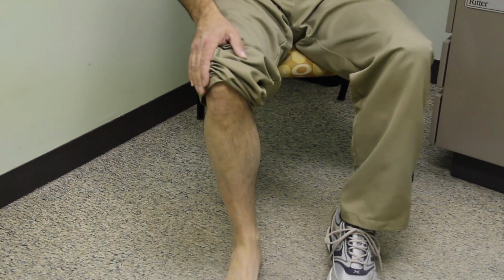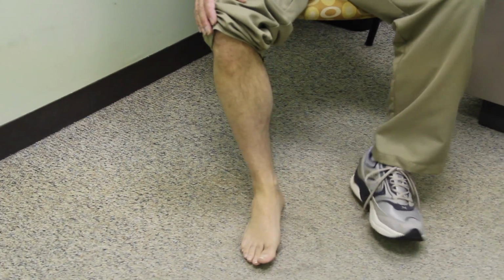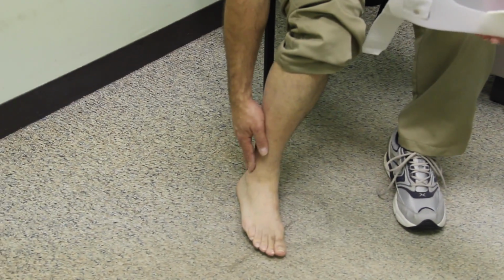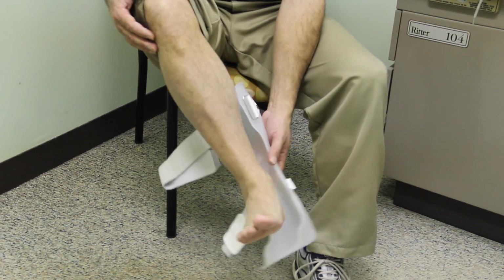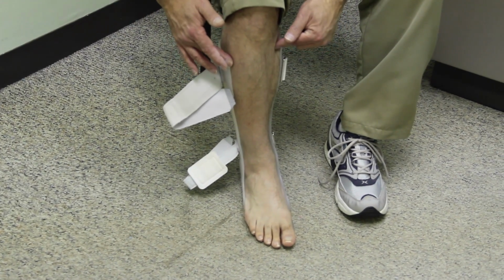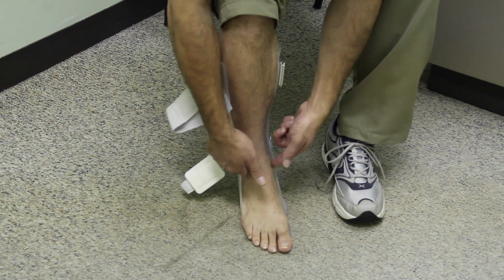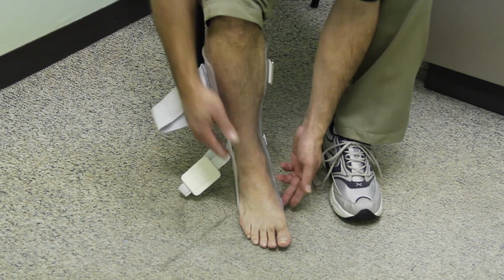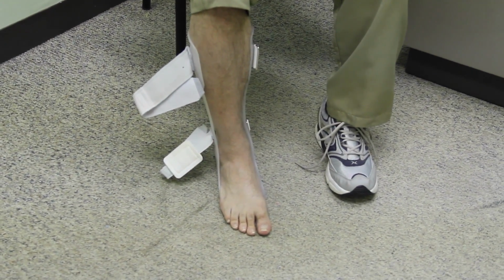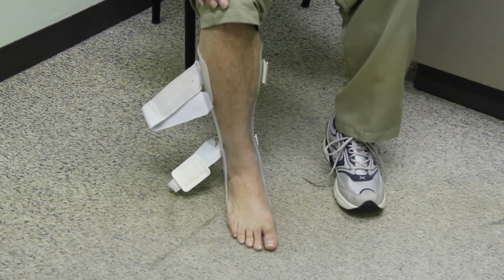I want to check their skin just to be sure they're not getting any pressure areas. I don't see any lines where it's red from pressure. I don't see any edge lines from the frame of the brace. Sometimes with a patient with swelling, in the beginning they'll get some edge pressure. So that's why we want to be really cautious as to how these trim lines fit to the patient. You can see the little bit of gap, but it's stabilizing my ankle with good arch support. So all in all, this was an excellent fit. Thank you.